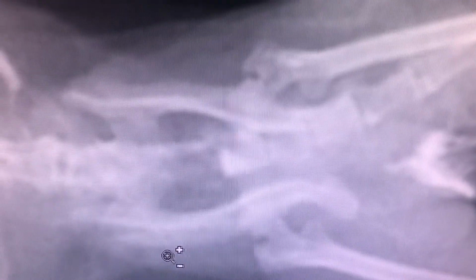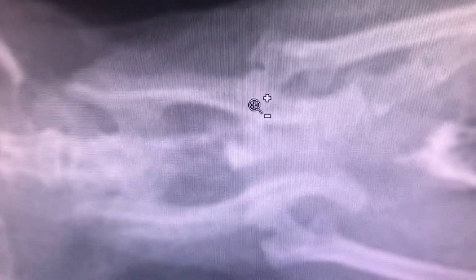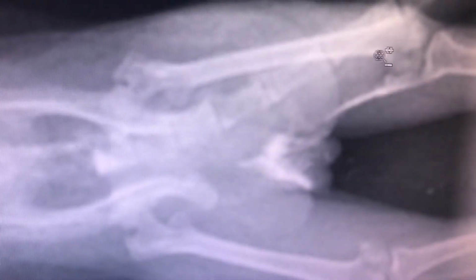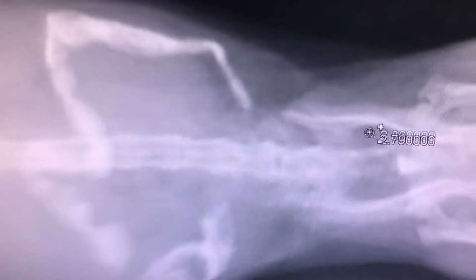And I'm not really seeing much evidence of anything. This here could be a fractured pelvis, but it's on the opposite side, so I'm not really sure how that would work. And the other view doesn't show a fractured pelvis. But anyway, the knees look okay here. She seemed most painful when I was stretching out her back for this x-ray. So anyway, let's shrink this down and go back into her spine again.